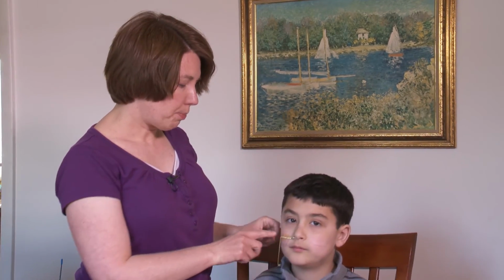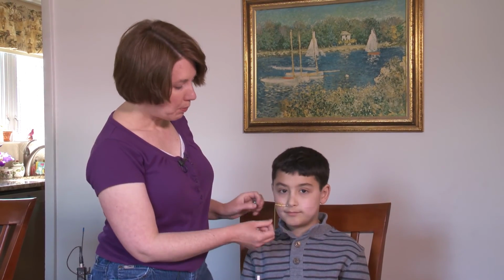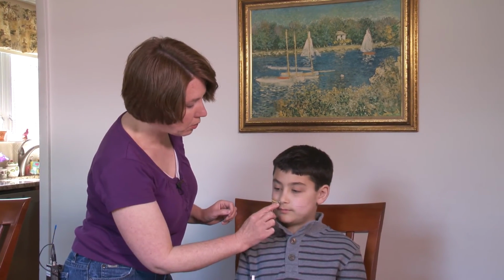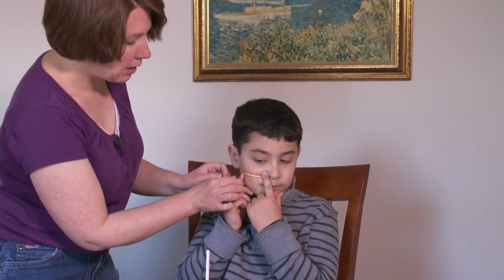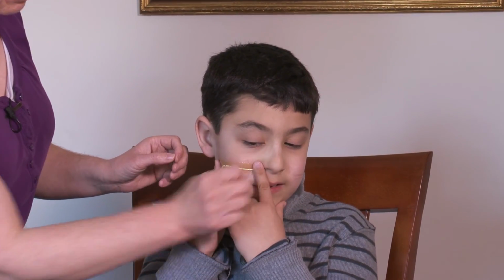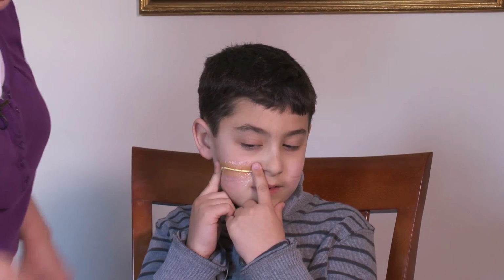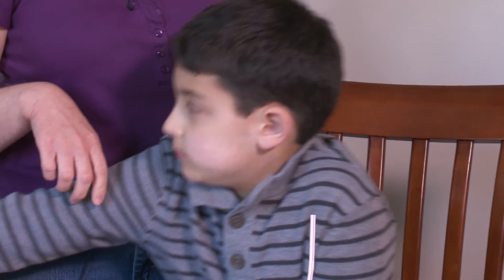And also when he takes a shower, we usually change this tape about every 3 days or so. It just starts to get wrinkled up on the edges and doesn't stick as good, and then we change the tape. When we change the tape, he just holds it for me with his fingers. Go ahead, show them how you do it. He holds it here, and then I kind of loosen it, and he pulls it off, and then I put a new piece. So we do that every couple days. And this tube we usually change once a month.